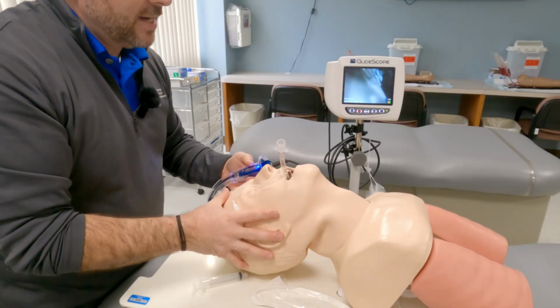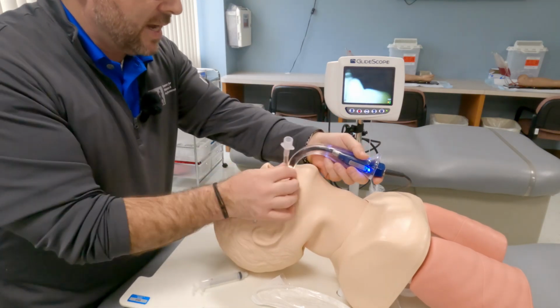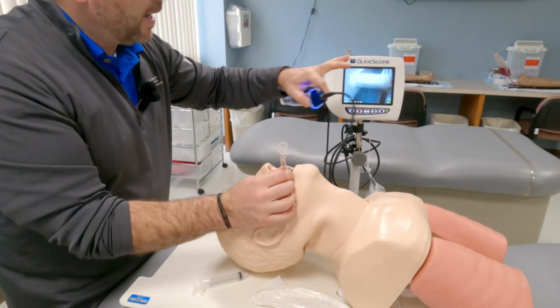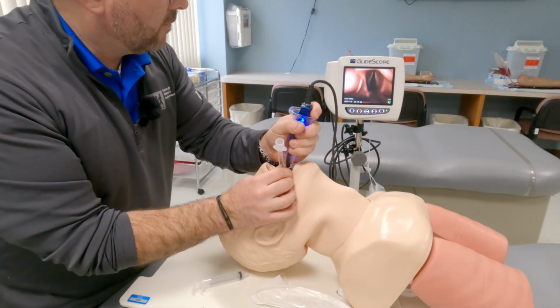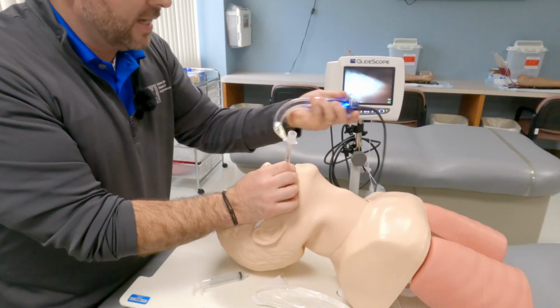If I want to check an endotracheal tube, let's say EMS has brought a patient in with the endotracheal tube in, very quick, you just go straight down the center, obviously secure your ET tube, down the center, take a look, okay, we're in the right spot. Everybody in the room can see that we're in the right spot. Vocal cords, there we go. Definitely in the right spot in this case.